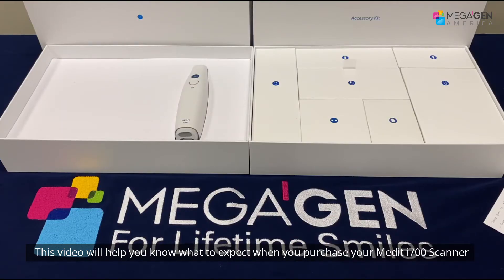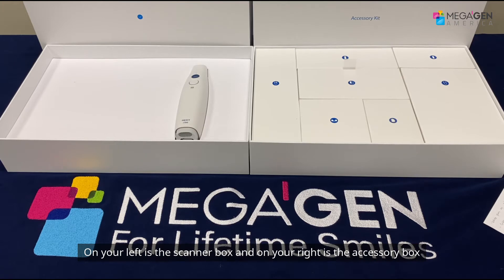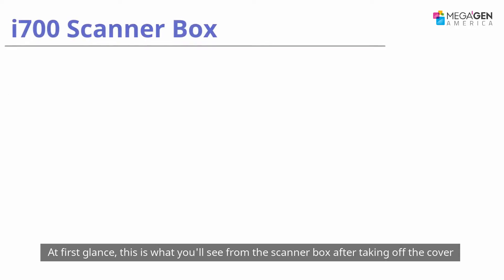This video will help you know what to expect when you purchase your Medit i700 scanner. On your left is the scanner box and on your right is the accessory box.